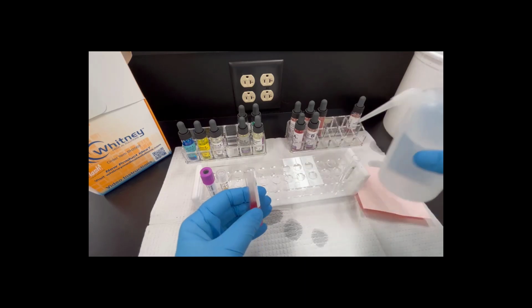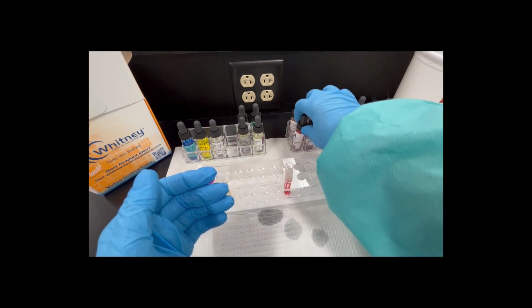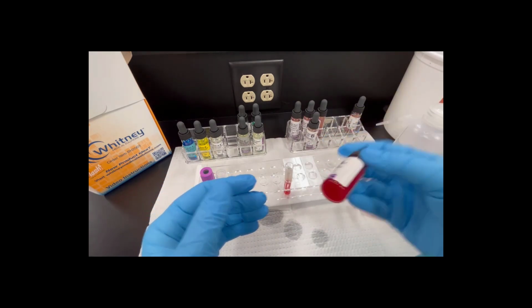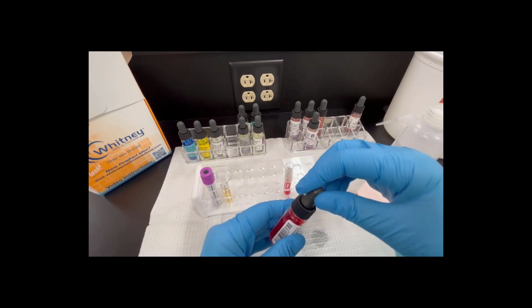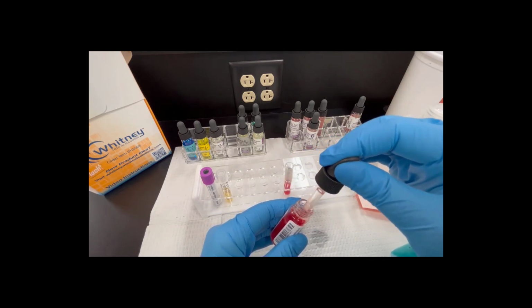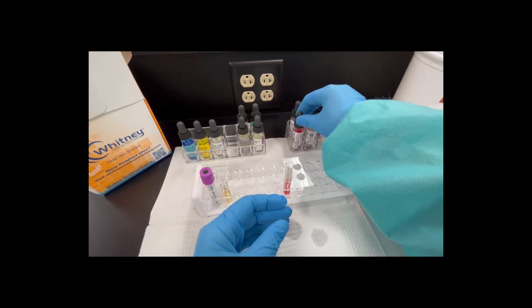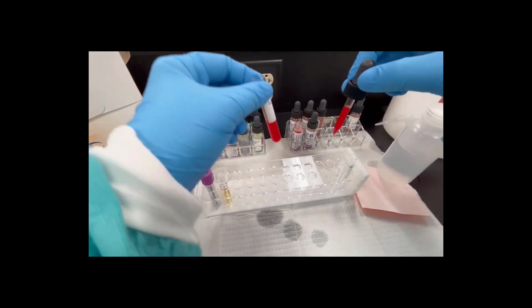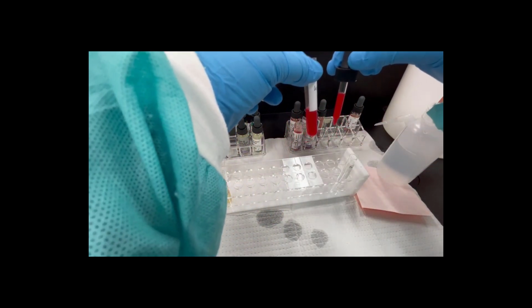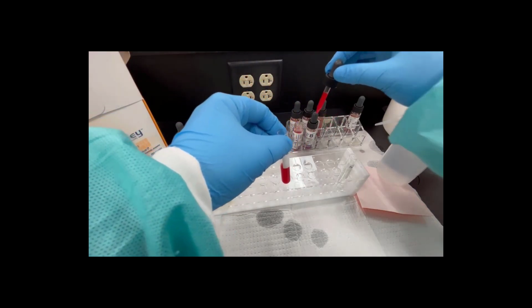We're going to add saline up until it's about a 3% suspension. When you're wondering, is it a 3% suspension or not? These guys are all at a 3%, so you can go ahead and pull them out. Make sure you go up and down a few times in the pipette. Try to leave them in the racks when you're using them, but you can hold them together, and those look pretty close. So that looks like a nice 3% suspension. You can hold it up to the light to see how it looks, but that looks good.